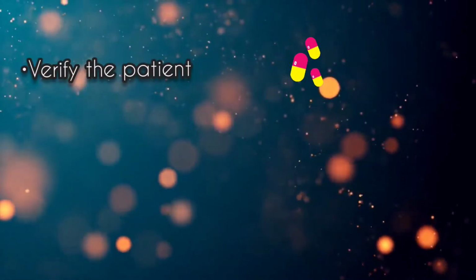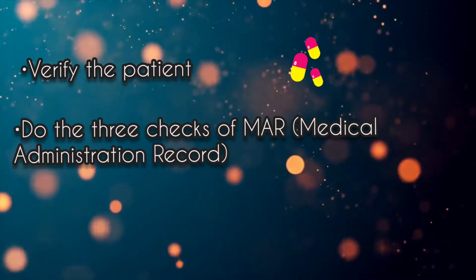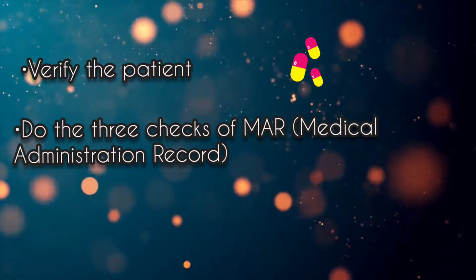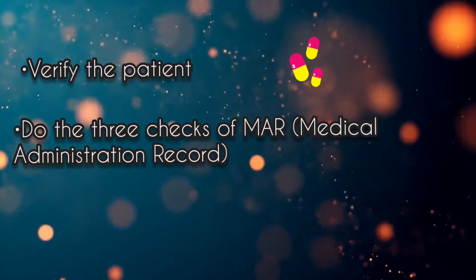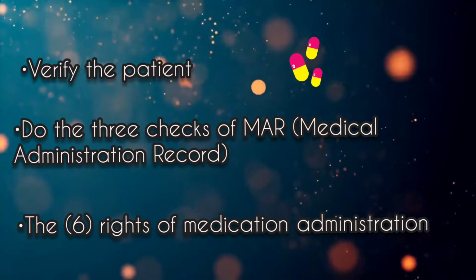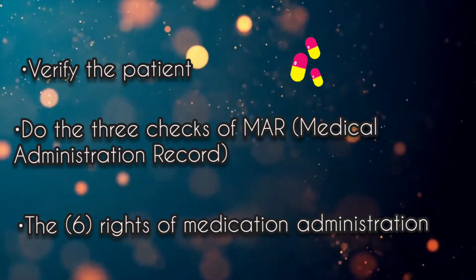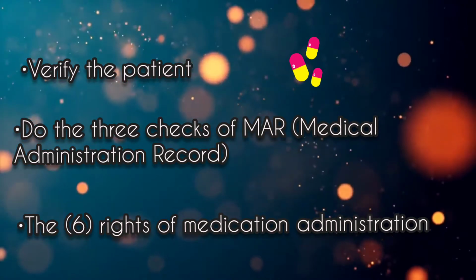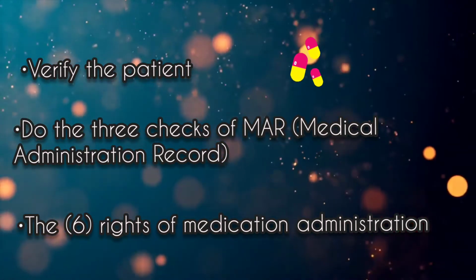After washing and putting on the gloves, verify your patient. Do the 3 checks of our MAR, or the medication administration record, and always remember the 6 rights in medication administration, which are the right time, right patient, right dose, right medication, right route, and the right documentation.